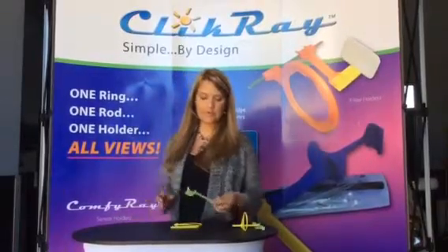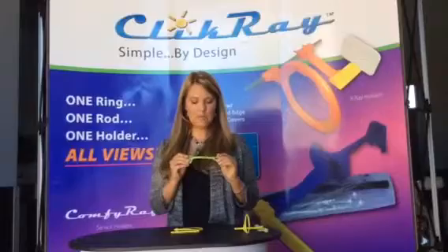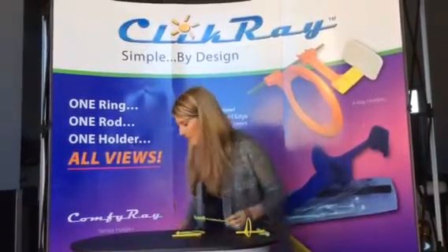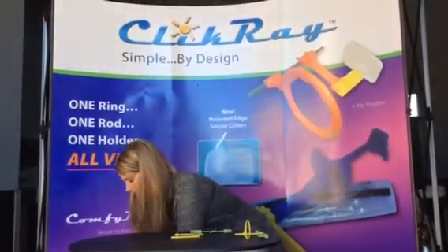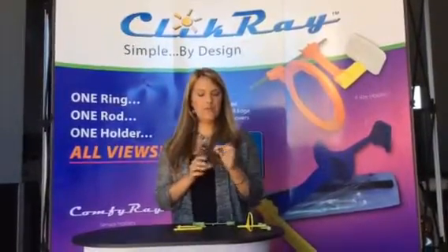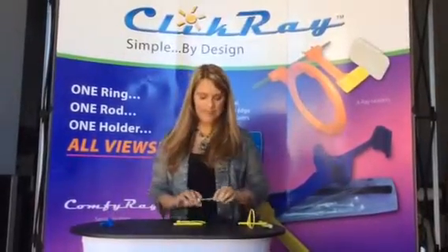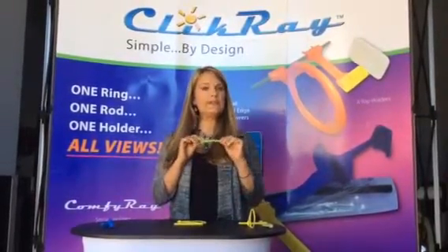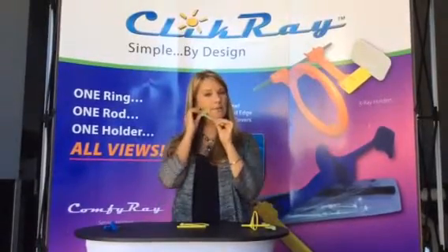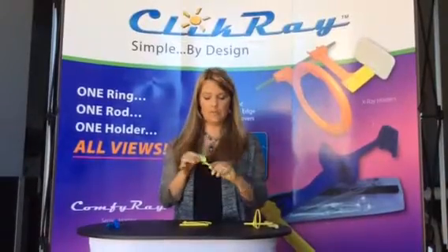One of the first things I really like to address with our system is the flexibility, and this is by design. When you have a metal system it is very rigid, and when you put it on a rigid bite block and put this in a patient's mouth you have a lot of discomfort. The only thing that's going to give is the patient's mouth. With our system, this little bit of flex allows it to flex instead of the patient's jaw or mouth, and it's going to be a lot more comfortable for them.